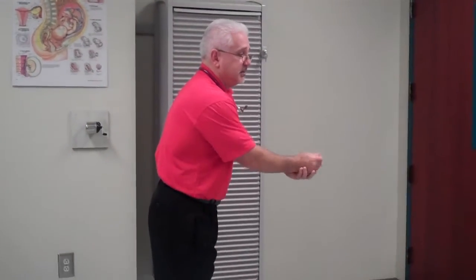Okay, so how do you feel now? I feel really good. How does your dyspnea feel now? How is your shortness of breath? I feel like it's loosened up a little. Okay, last time you said it was a 3, 5 being the worst. What would you say it is now? Probably a 2. Okay, good, very good. Well, do you have any questions for me? No. Okay.